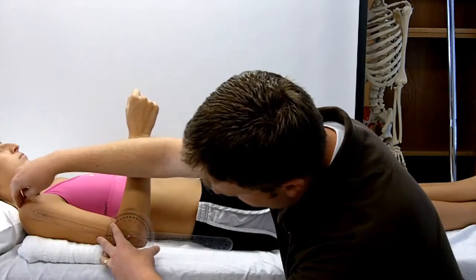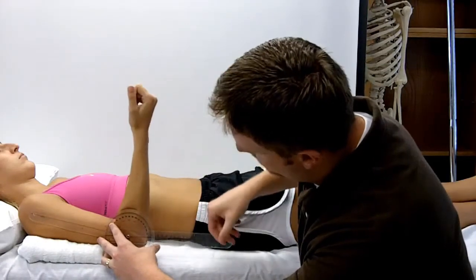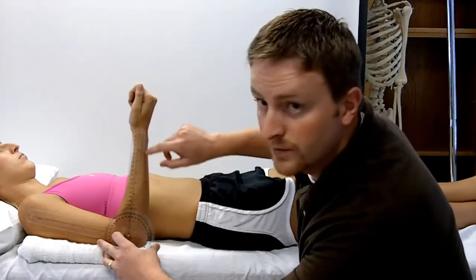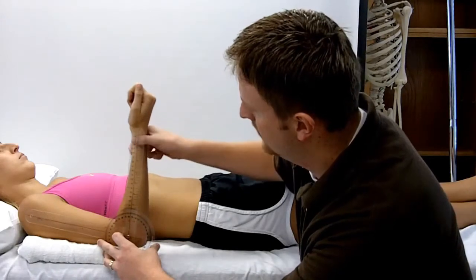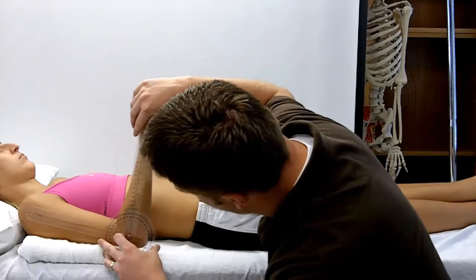Once you've located that, you can hold it steady. The movement arm follows the longitudinal axis of the radius. An easy way to find that is to find the radial styloid process and place your goniometer there.